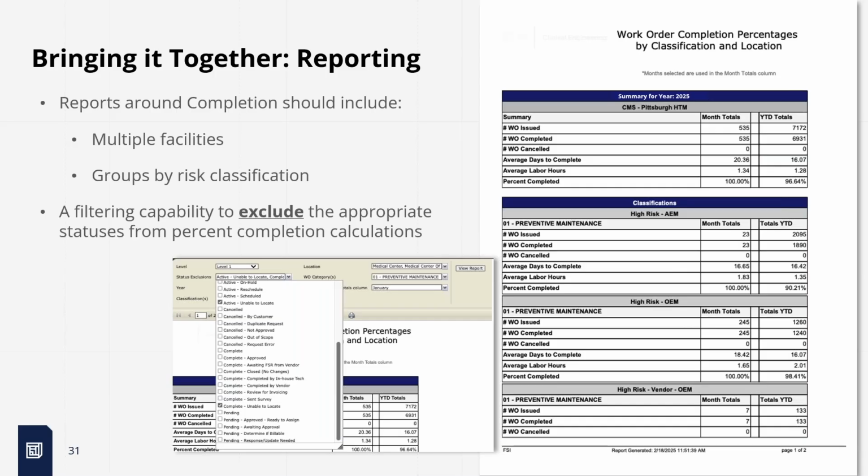Why can't we call this type of equipment the same for whatever hospital you're at? If you're using things like ECRI to classify your equipment, that's great, but not everybody is. So what is the real standard? If you go from your hospital to another hospital, why do you have to reinvent the wheel? As hospitals merge, why are we constantly making data look the same?